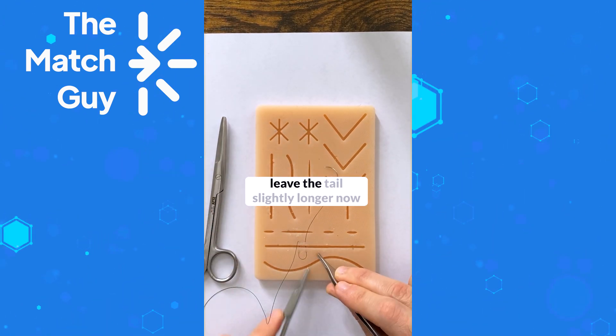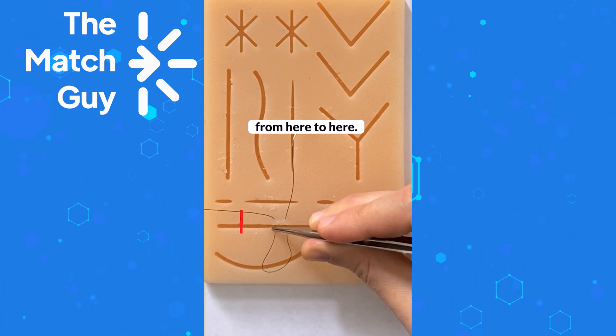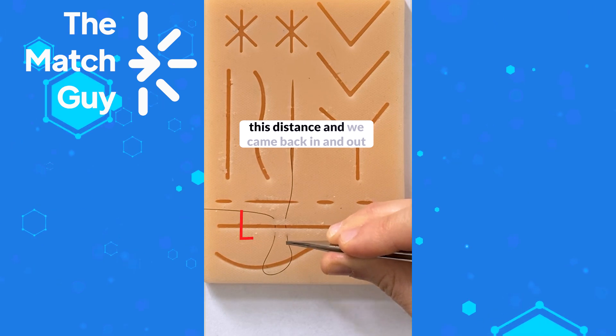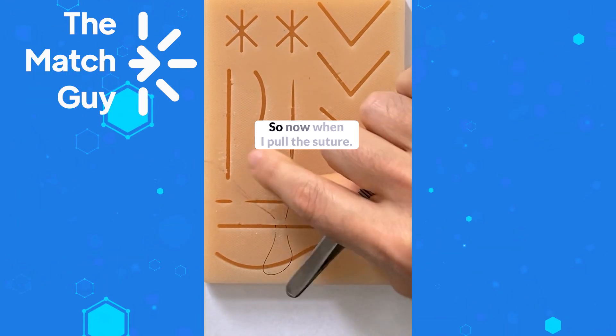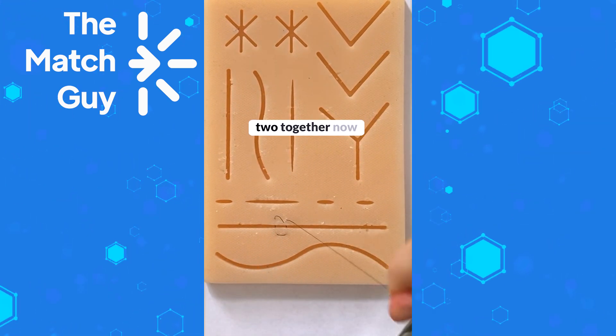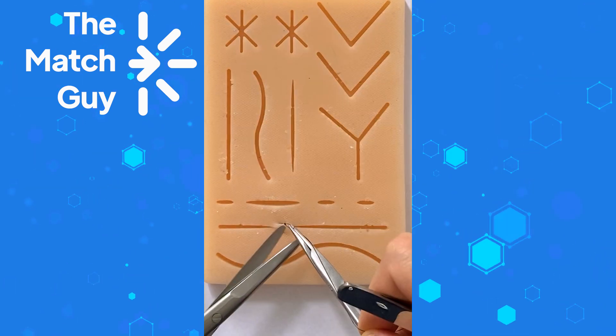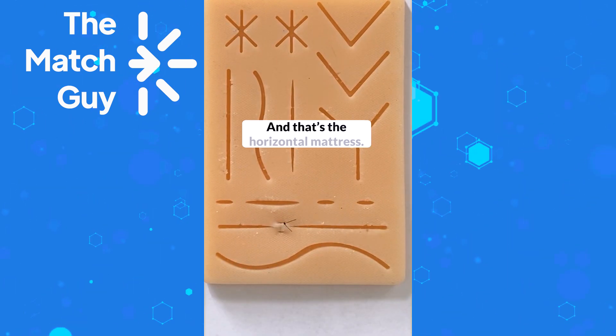Leave the tail slightly longer so you can see: we came from here to here, then jumped this distance and came back in and out. When you pull the suture, you can tie these two ends together — one, two, and three — then cut. That's the horizontal mattress.